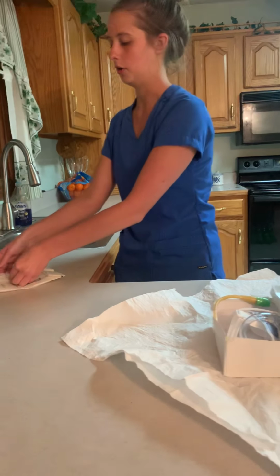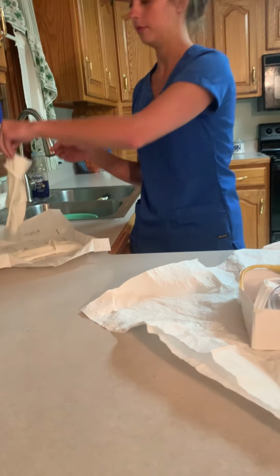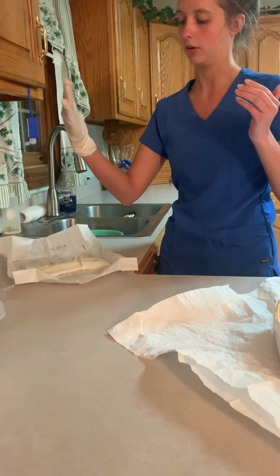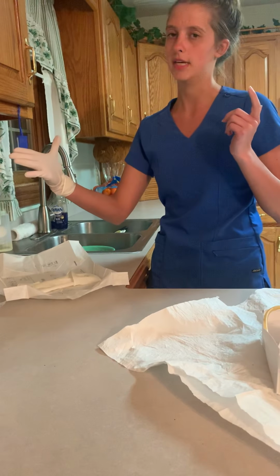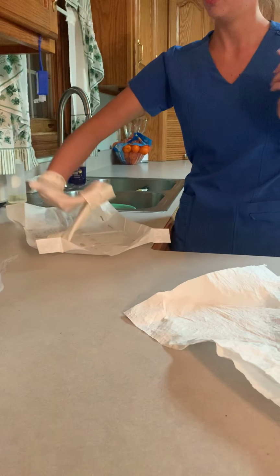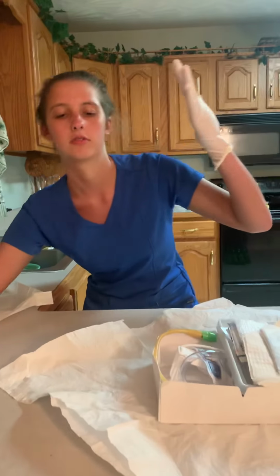So we're going to go ahead and open the sterile gloves. We're going to pick up the cuff, hold it above our waist, and put on our gloves. Then we're going to pick the second cuff up, and we're going to make sure that we keep our thumb out and don't let it touch it. So we're going to pick up our second cuff, hold it above our waist, put on our gloves, use our elbow, swipe it down. We're going to keep above our waist.